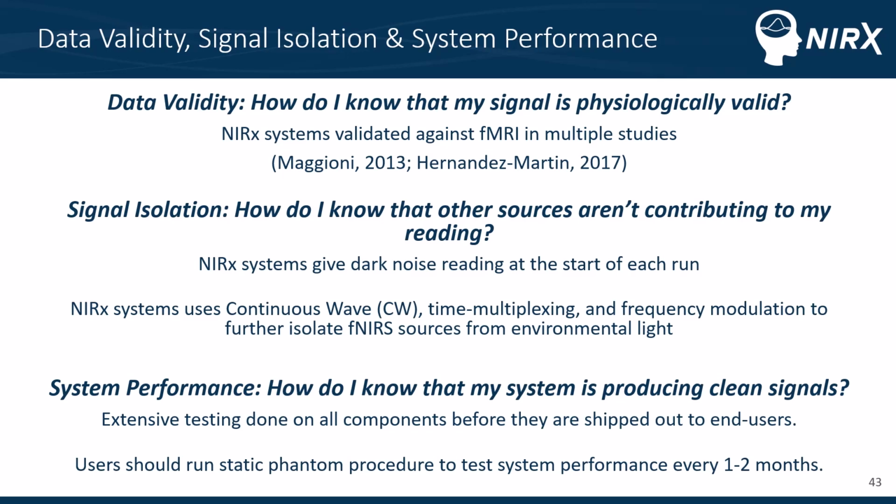In addition, users should run the static phantom procedure to test system performance every 1 to 2 months. Every user receives a static phantom brick in which the optodes are placed and then covered with a black laptop case. And then you run a system optimization and you determine the performance of those optodes. So you can say with confidence if your optodes are performing well. We provide a manual with that so you understand the procedure and your results of the procedure.